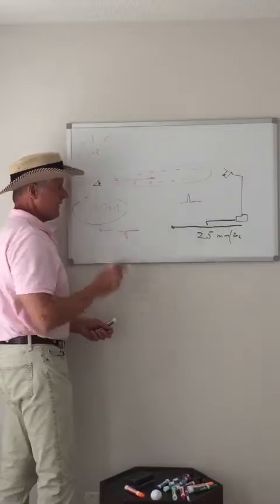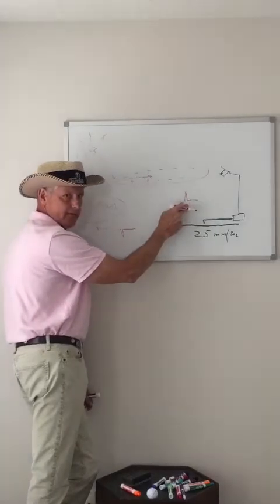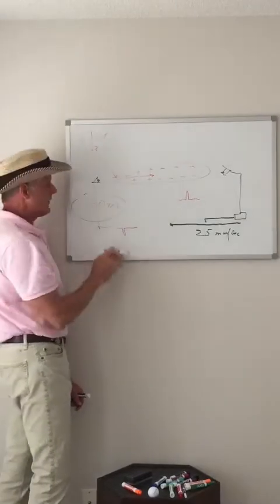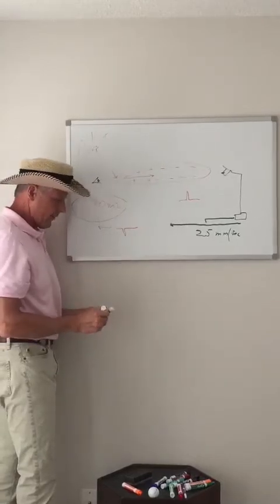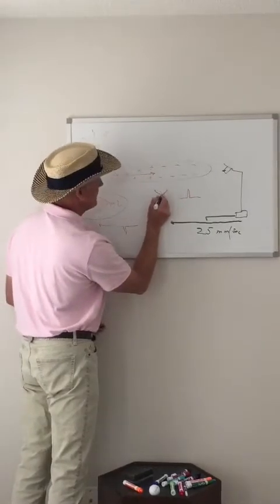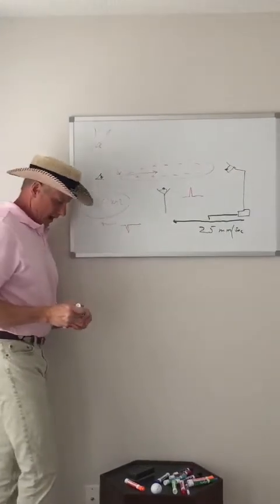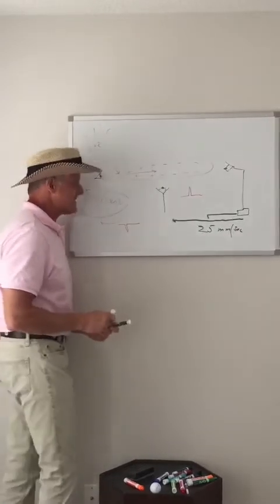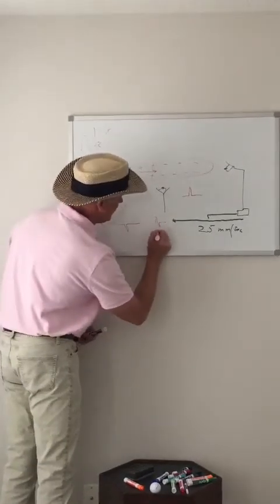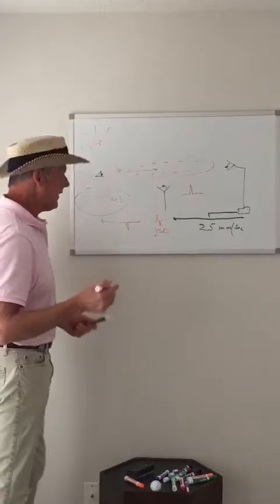All right? So, if a wave of depolarization goes towards an eyeball or EKG lead, we get an upright or positive deflection. If the EKG lead sees a wave of depolarization going away, it's going to inscribe a negative deflection. Well, what if I were to put an eyeball up here? Or down here. I'll put an eyeball here, hook it up. What sort of QRS complex or wave would it draw? Well, by design, it will record a deflection that is equal up, equal down. And that is called an isoelectric deflection. Equal up, equal down, all the same.